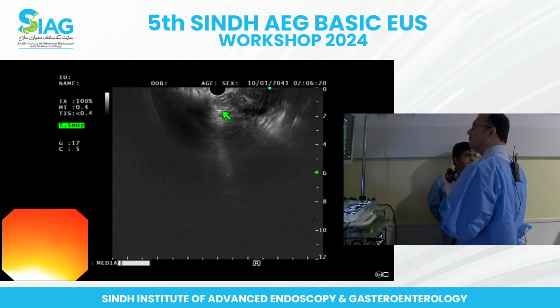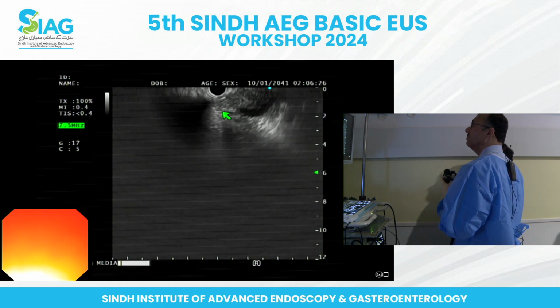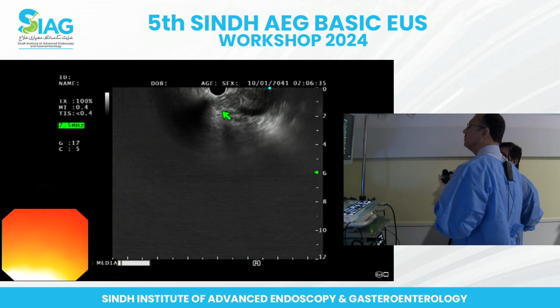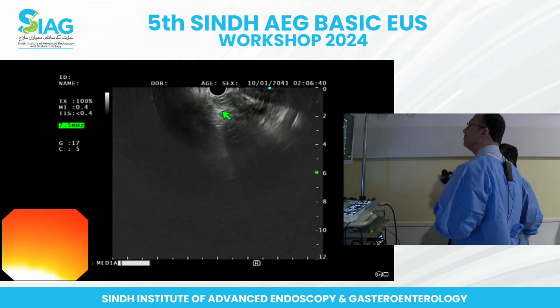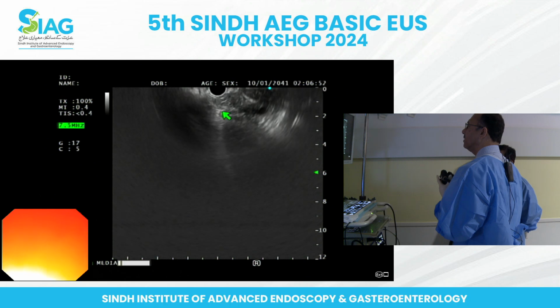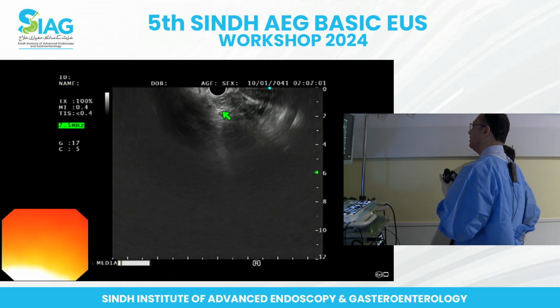Any comment from the hall? Are you with me? Yeah, these are always challenging cases because you don't know how aggressive to be, and one of the risks we were discussing is potentially causing damage to the pancreatic duct. Yeah, I've intentionally tried to stay away from the pancreatic duct, and I've taken the biopsy parallel to and close to the previously placed stent, because that's the place that I expect. If I find anything abnormal, I'm going to find it at this particular area.